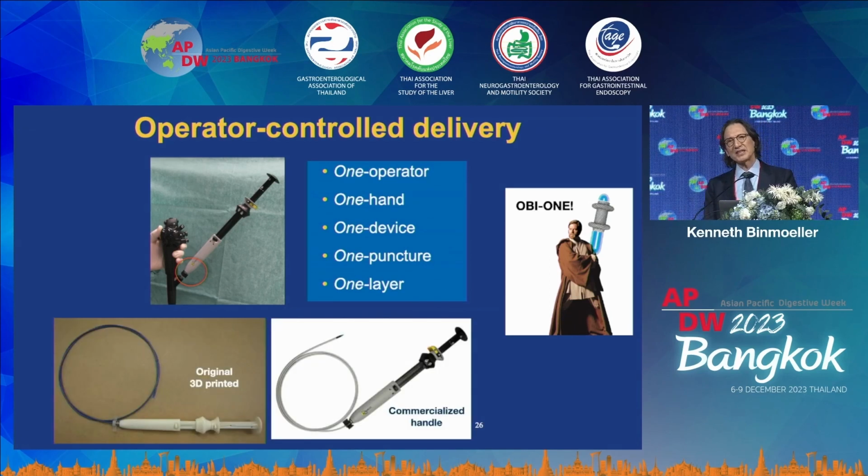Now, we came up with this handle design, and I have to say in retrospect, the handle looks the same as our original 3D printed handle that we had, and it has really stood the test of time. And in fact, you see the X-Lumina logo here, but now it's been replaced with Boston Scientific, but it's the same handle. So I'm very proud of this handle that the engineers and I came up with.